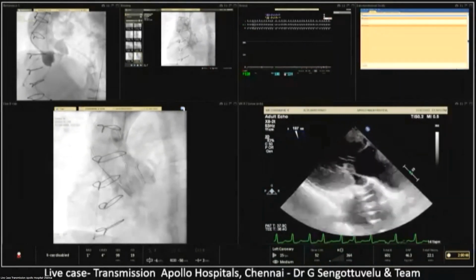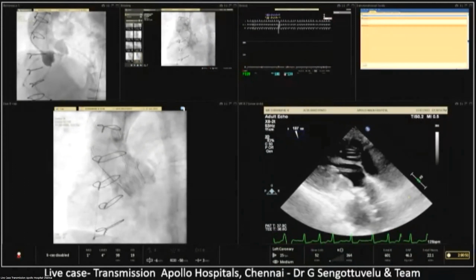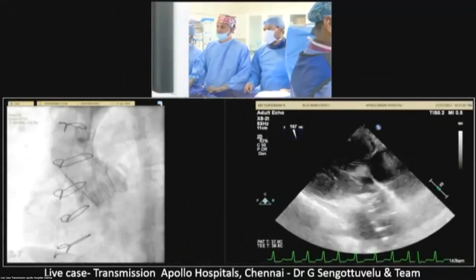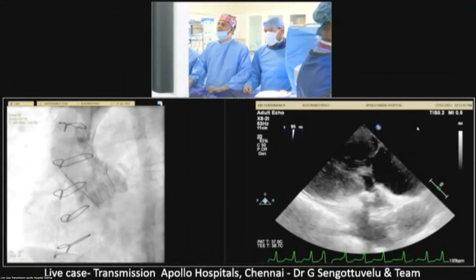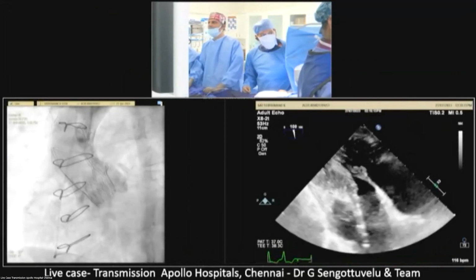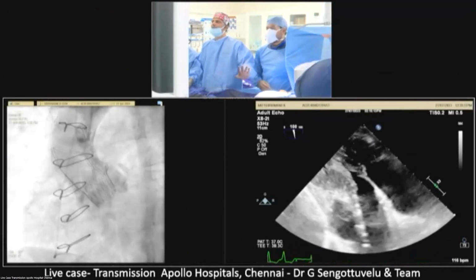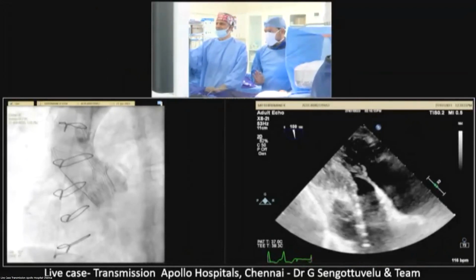It highlights some of the issues of where seal occurs in a bicuspid valve. The seal is on the leaflets. It doesn't need to be at the annulus, and it's about stabilization and seal. You have a good seal, good hemodynamics, and the valve appears stable. So I think it's valid and reasonable to continue to follow, and I expect this patient will do well with this result. If you look at this echo, Sushil, the lower frame of the valve is almost close to the hypertrophied ventricle.